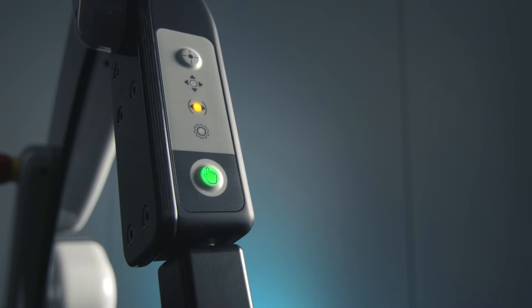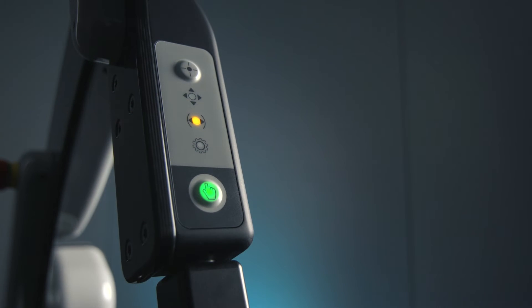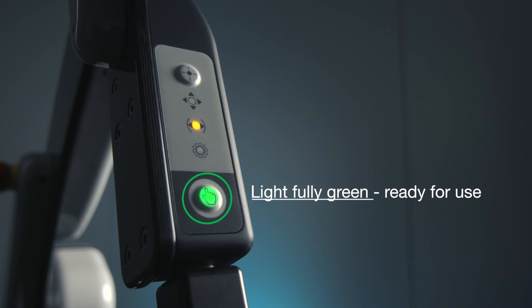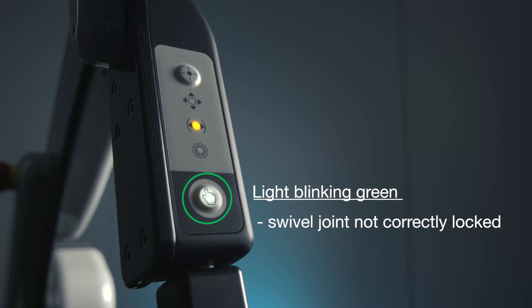The control panel consists of two buttons and three indicator icons. The bottom button unlocks the Artip Solo for manual positioning. When fully green, the arm is connected to power and ready for use. When blinking green and no button has been pushed, the swivel joint at the distal end of the holding arm is not correctly locked into place.